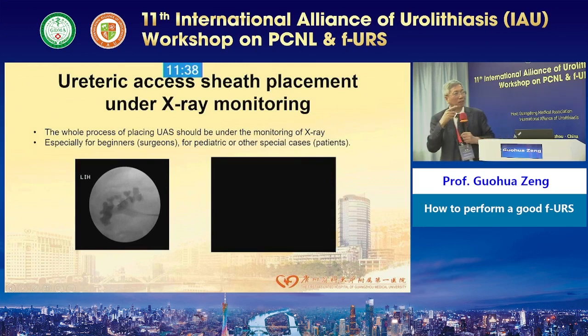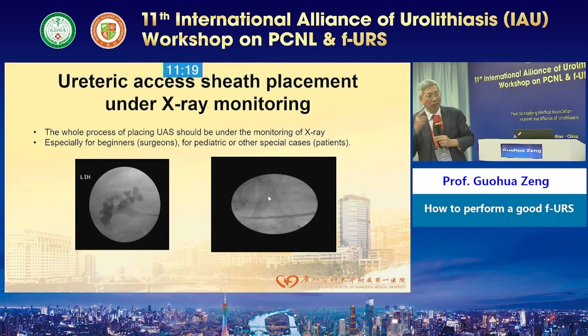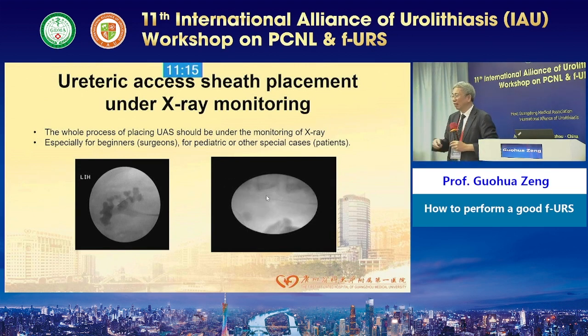But actually, for a beginner, we must use X-ray. Professor, if you do 1,000 flexible cases, maybe you can go without X-ray. Sometimes for pediatric and special cases, horseshoe kidney, ectopic kidney stone, maybe you can use it. Agree? Yes.